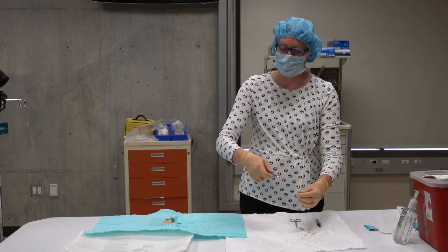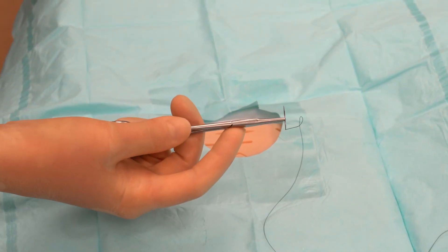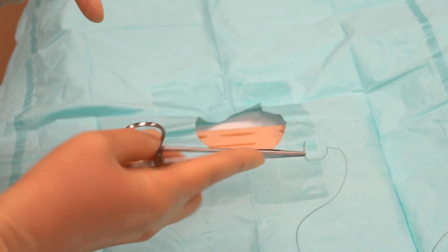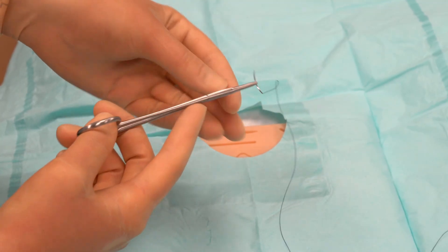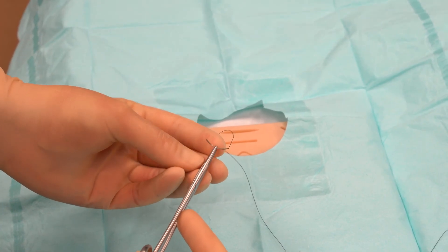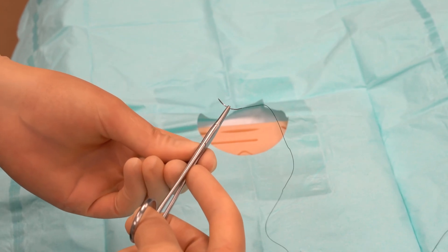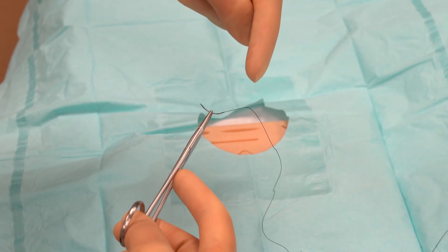With my dominant hand I'm going to hold the needle driver. I'm right-handed, so I'll hold it with my right hand — thumb and ring finger inside the holes, index finger pointing toward the end. This gives you better control and the ability to twist your hand around. The needle is loaded at the very end of the instrument with the tip facing away from the palm, and held right in the middle of the curve so there's equal needle in front and back. That gives the best control.